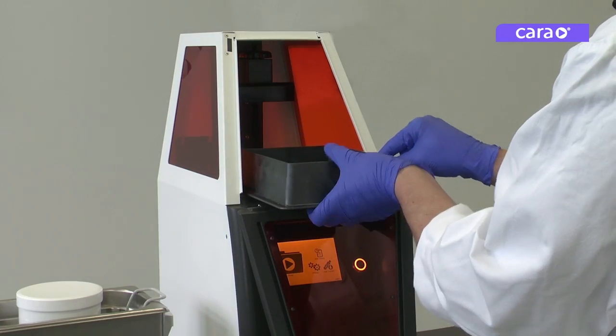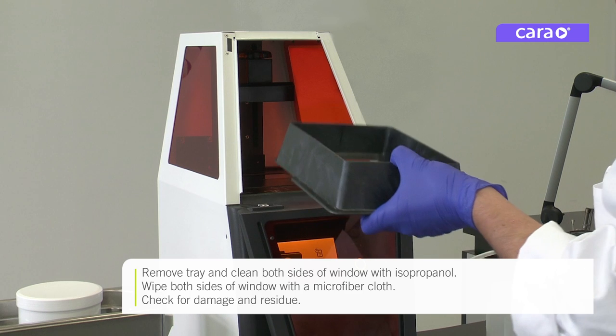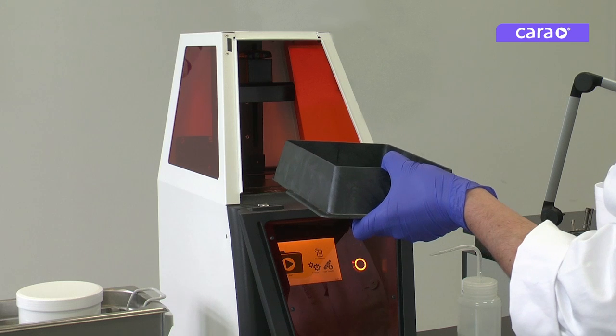Remove the tray and clean both sides of the illumination window with isopropanol. Wipe both sides of the window with a microfiber cloth and check for any damage or residue.